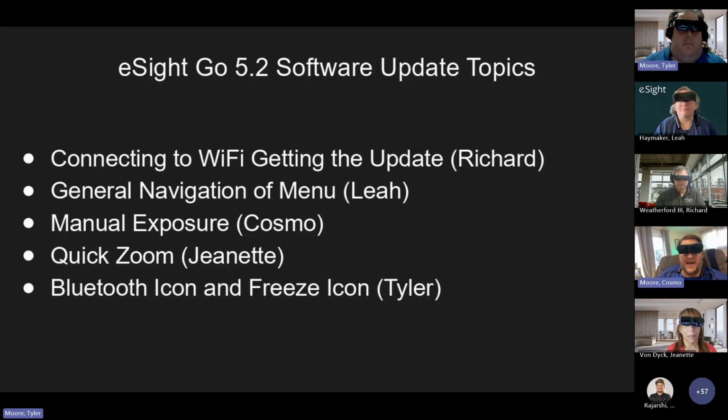If I want to go back to auto, I can just do a long press of the mode button, reset view. Now I'm unzoomed, tilt is back to normal, and I'm back on auto exposure. So I'm going to get back there. Oh, I went too far. So in general, you're going to be turning the exposure down, which lets less light in.